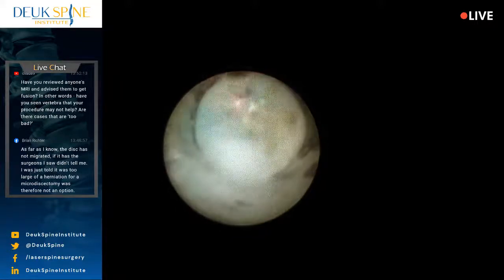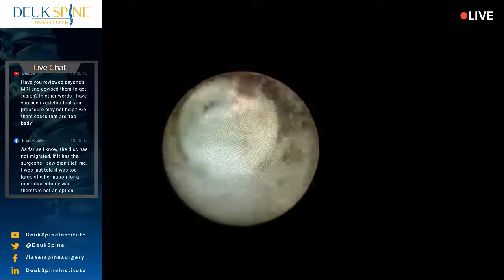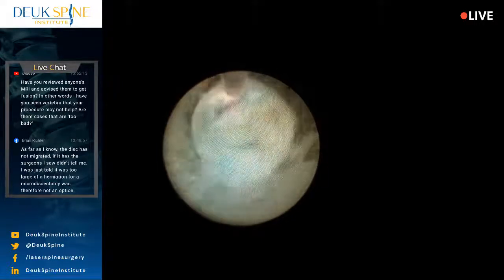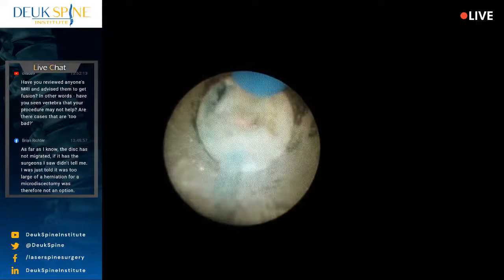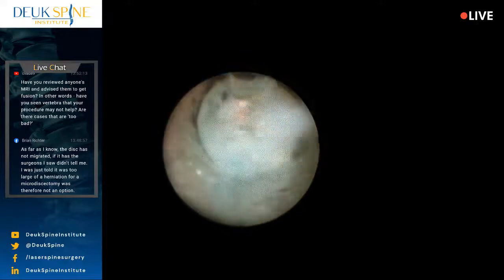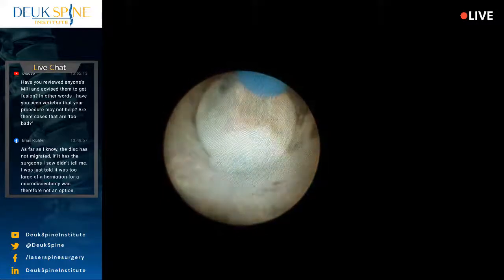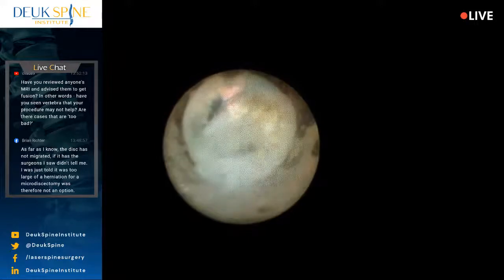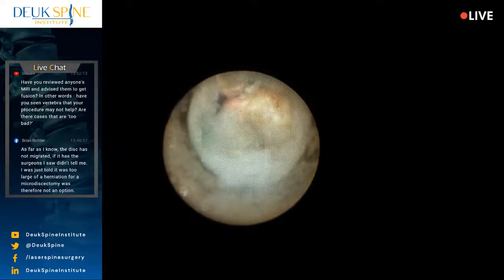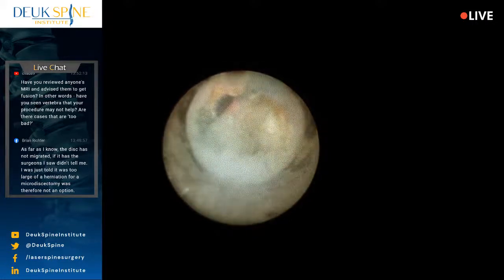The comment reads, have you ever reviewed anyone's MRI and advised them to get a fusion? Yes, I have. Oh, look at that herniation. Did you see it come out? That was pretty cool, huh? But very rarely. There are going to be some people who would be better served with a fusion, but probably 1 in every 100. So think about that. 99% of the time, the laser surgery will be what they need.